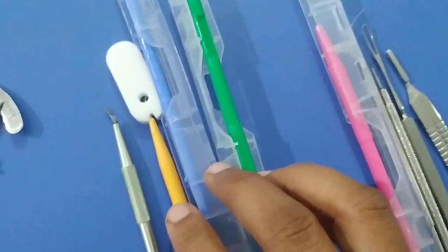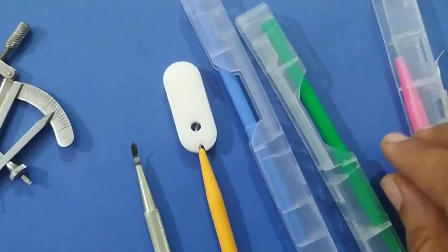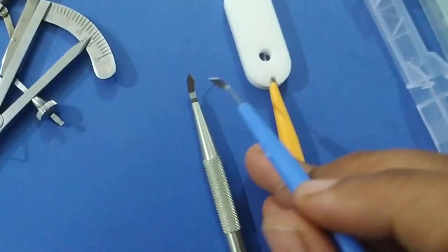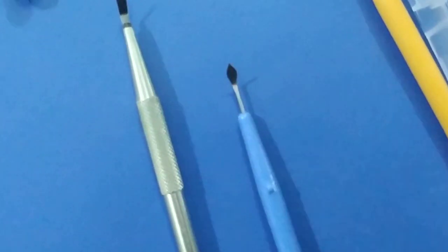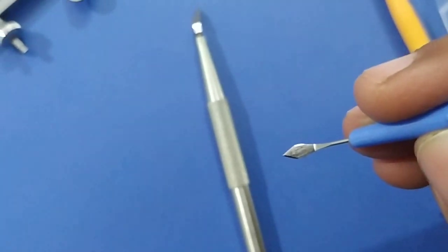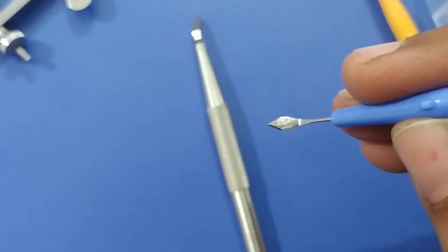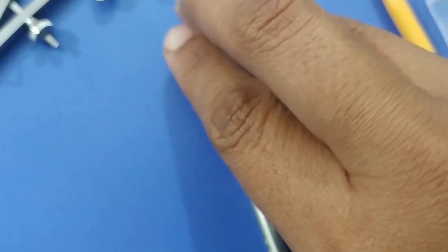Now we move to disposable blades. This is a non-disposable type of keratome, and this is a disposable keratome. The keratome has a diamond shape — the front end is sharp and has a diamond-type shape. The keratome is used for making an incision during phacoemulsification and during anterior chamber entry in small incision cataract surgery.